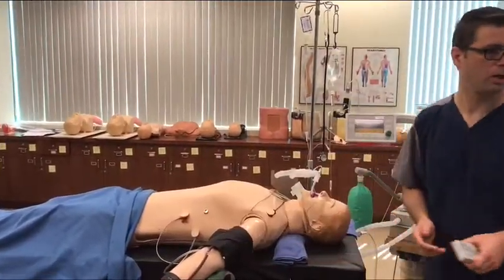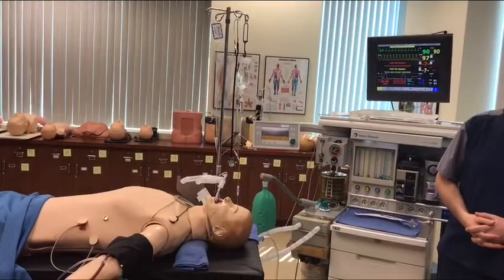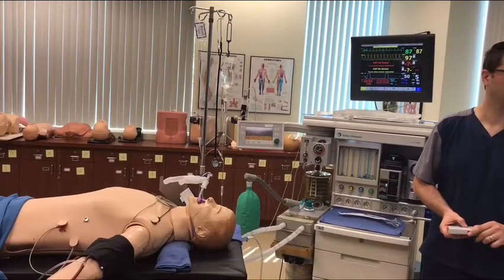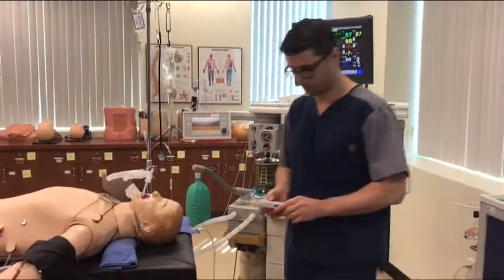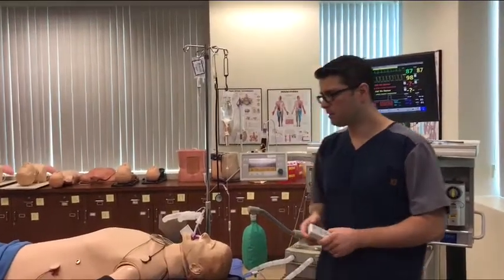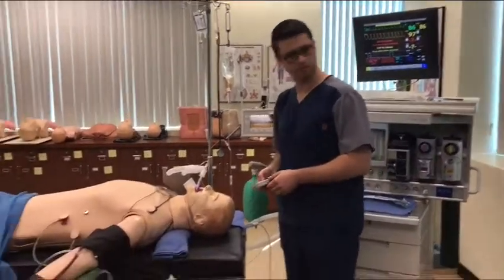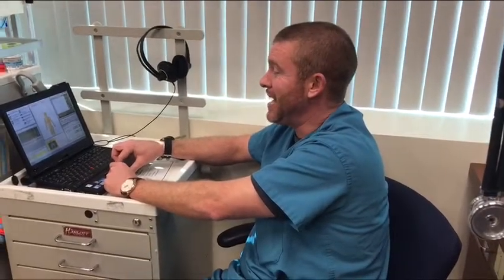Ready to be activated? It could be up to about 70. What would you want to do? I will do a tetany to see if there's a sustained response. What would be the stimulus? 50 or 100 hertz. 100 hertz, 5 seconds. Is the patient able to be stimulated with tetany right now? Eyes are still closed. Probably. Not probably. The longer you wait, that answer is going to be no. If the eyes are closed and he doesn't look like he's initiating any respirations yet, it's probably a good idea to do the tetany now.